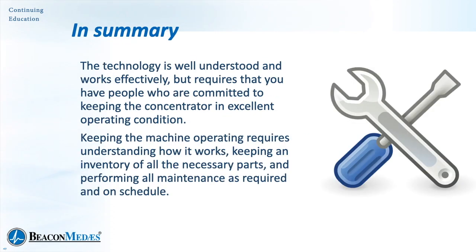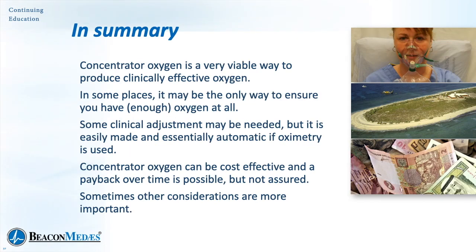So the technology is well understood. It works effectively. It does require that you give it appropriate attention. You can't run a concentrator and expect that you can just ignore it. You've got to pay attention to it. You've got to make sure that you understand how the machine works, you have the parts available, and that you perform maintenance as required and on schedule. But given that, concentrator is a very viable way to produce clinically effective oxygen. In some places, it may be the only way.